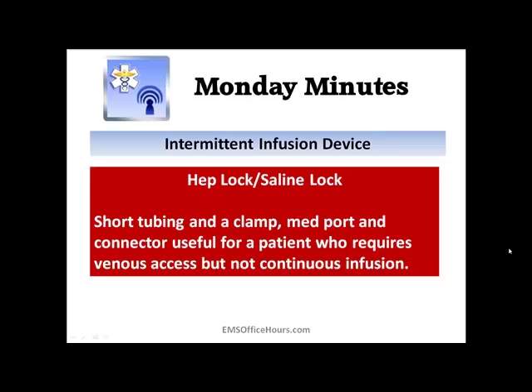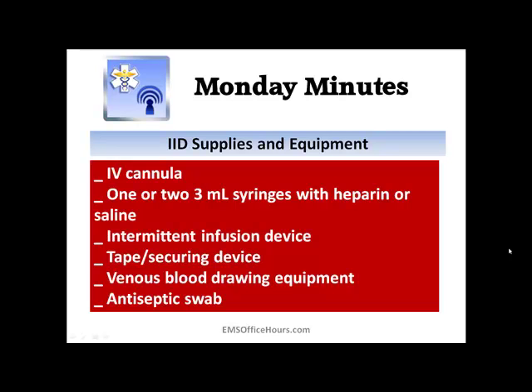Okay, and this is for patients who you just need to get IV access. Maybe you're anticipating giving medication. Maybe you're anticipating giving fluid, or sort of a just-in-case type thing, right? So that's what you're going to usually use saline locks for. Now, just real quick, I want to go over sort of the anatomy of a saline lock, and this is also commonly known as an IV start pack, right?